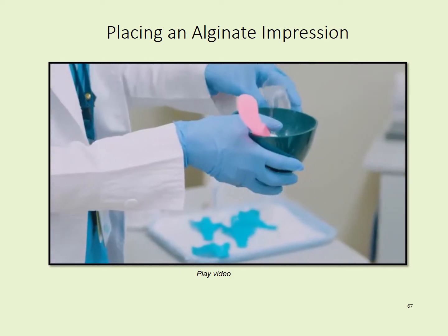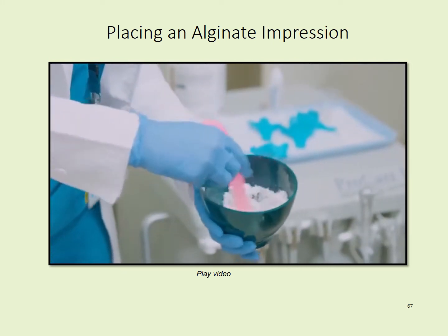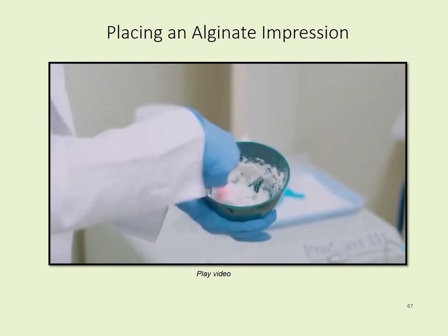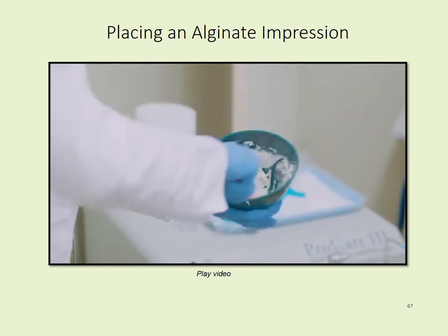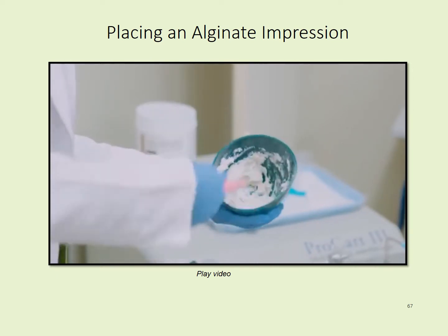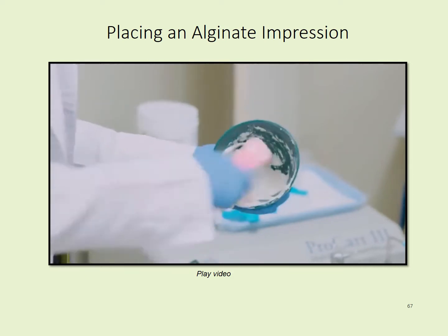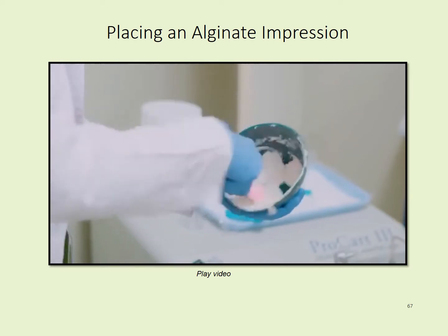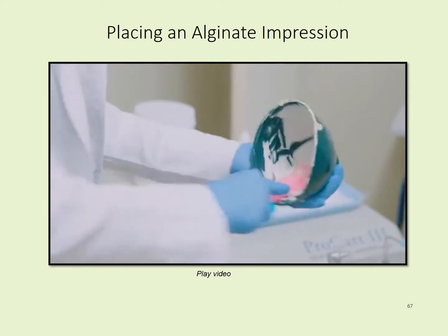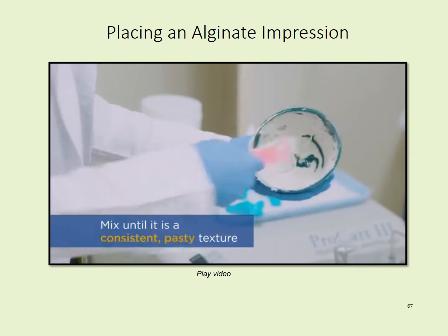Place the water into the material, and you go ahead and mix. When mixing, you want to make sure all the material is wet before you start using the sides of the bowl to press out all the air bubbles. Again, now that everything is mixed, we are going on and making this material a smooth consistency.